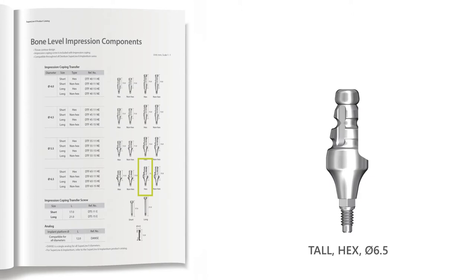However, for the purpose of this video demonstration and for the ease of working with the stiff silicone for the soft tissue model, a smaller 4.5 mm diameter coping will be used.